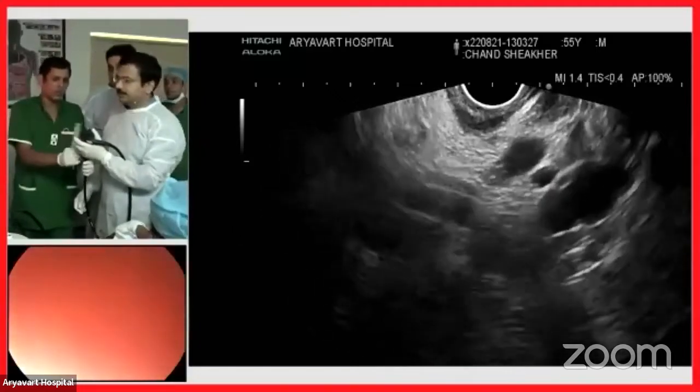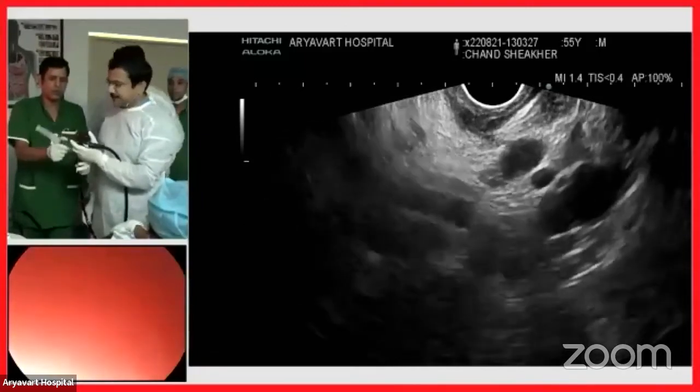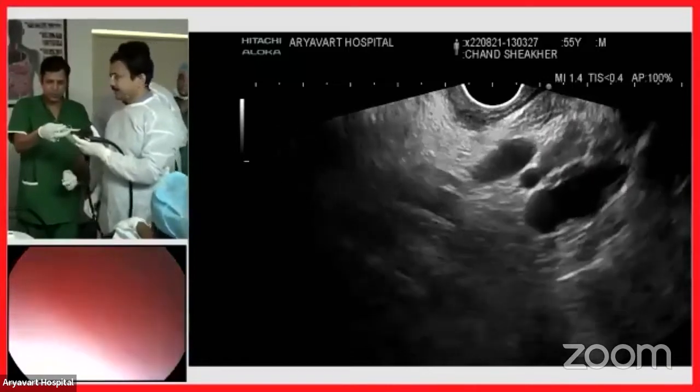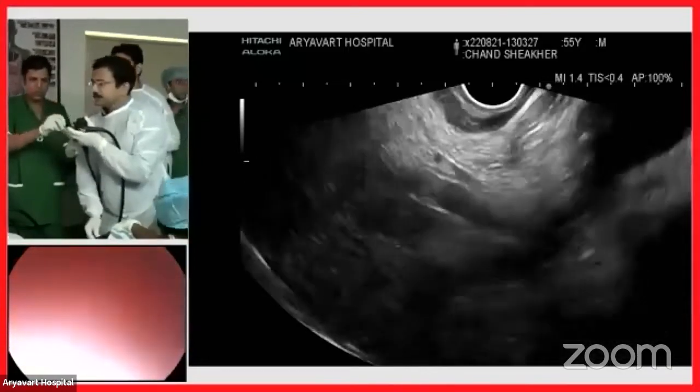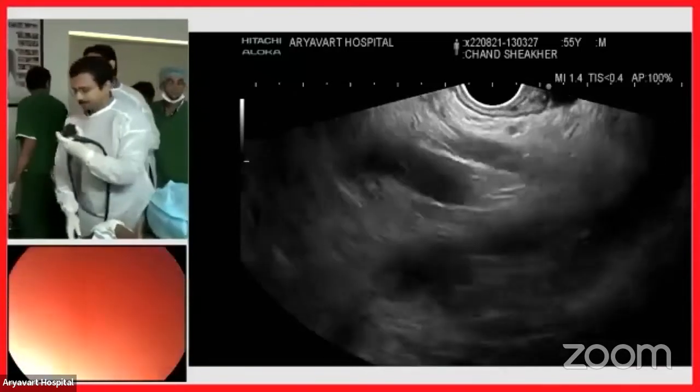This is a middle-aged male with cirrhosis and varices. This patient does not have esophageal varices but has isolated gastric varices — IGV1 — with red color sign (RCS), and the patient had presented with bleeding.